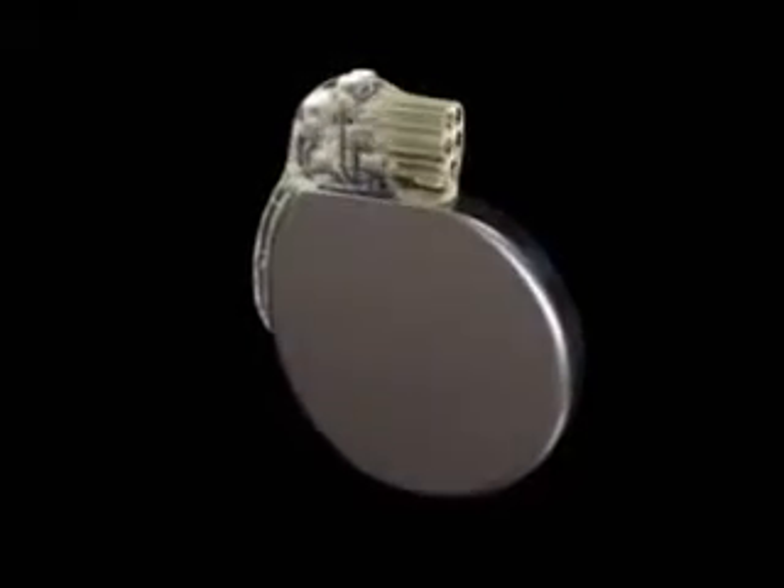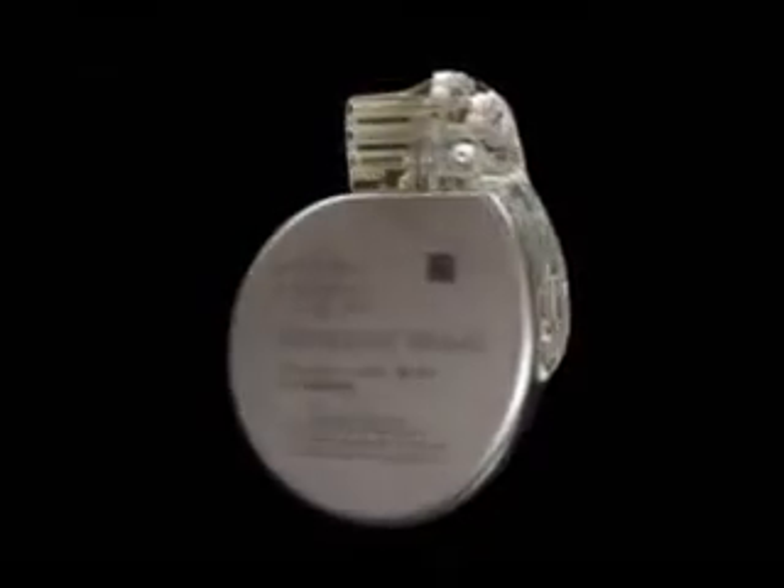Pictured here is a cardiac resynchronization device that is implanted in the chest of a patient with heart failure. The device is about the size of a cookie and generates electrical impulses that synchronize the heartbeat.